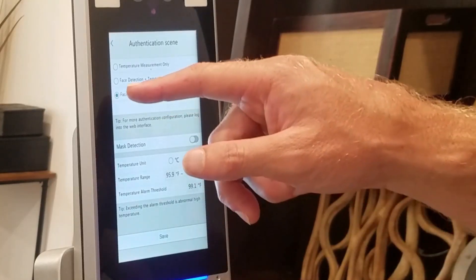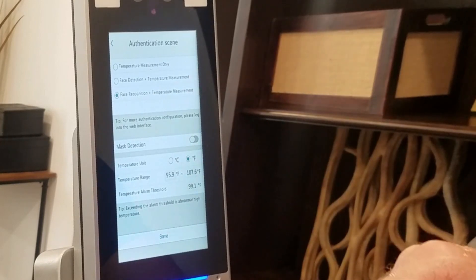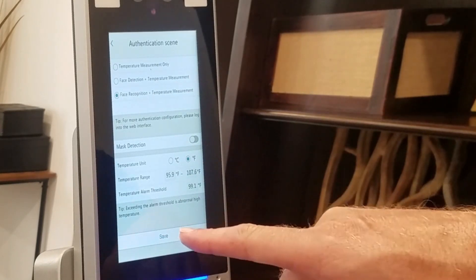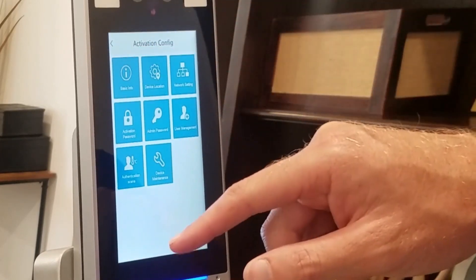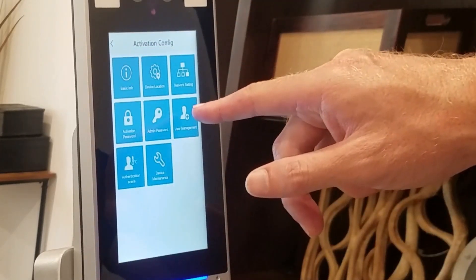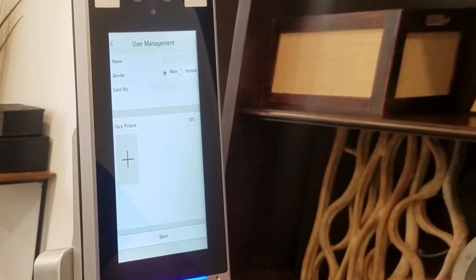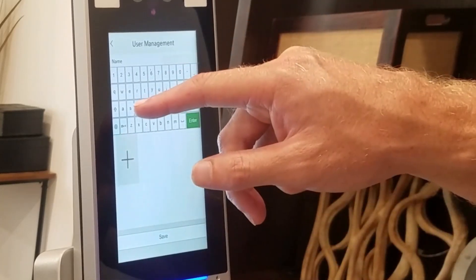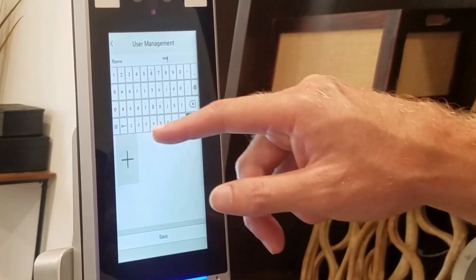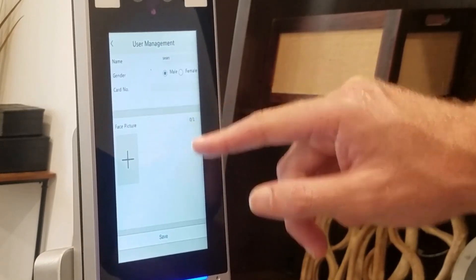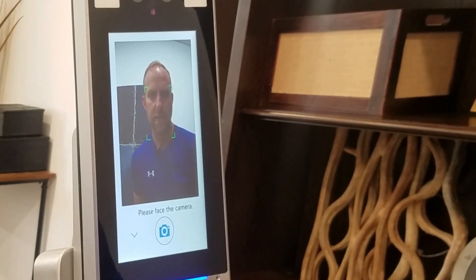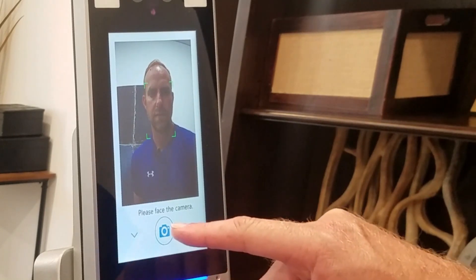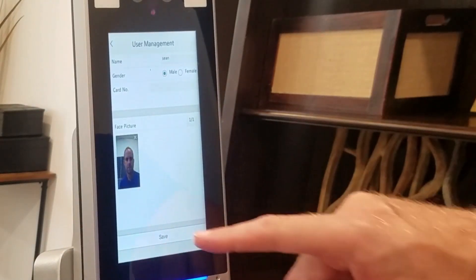For face recognition, turn that option on and click save. Then go back and go to User Management — this is where you add your face. Type in your name or the name of the person you want to add, then position yourself in the center of the frame to capture your face.